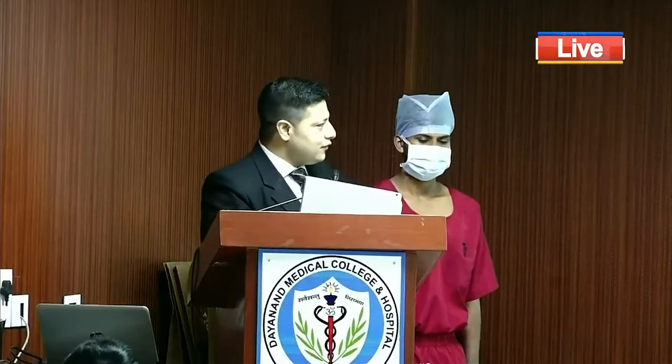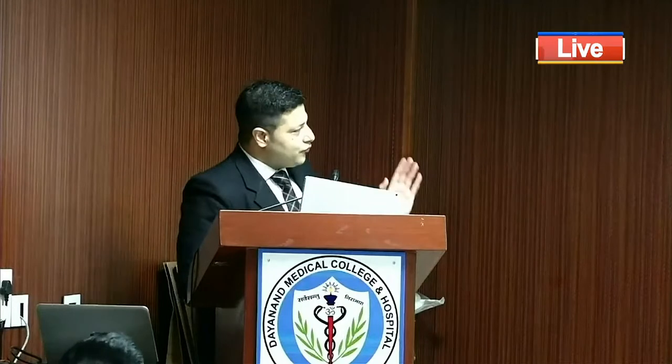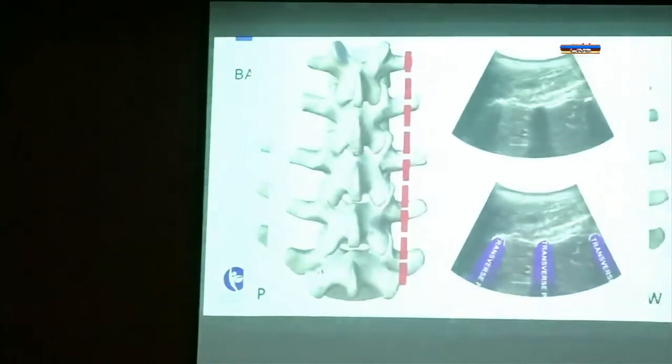You can't put the needle here. So to see, either you have to come from here or you have to cut me. Okay, you will not cut me, I'm sure. No way. So you have to come from slightly laterally. Okay, so I will show you. Thank you. So if we go further ahead, now what happens is we see very nice structures. Now these are the best structures because they cause the best shadows. It is very easy for the beginner to identify.